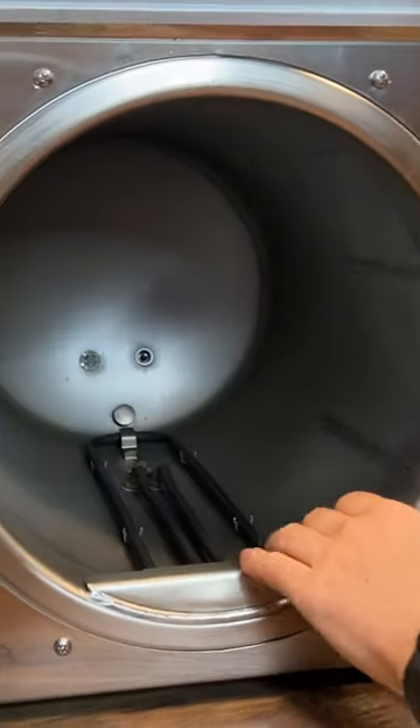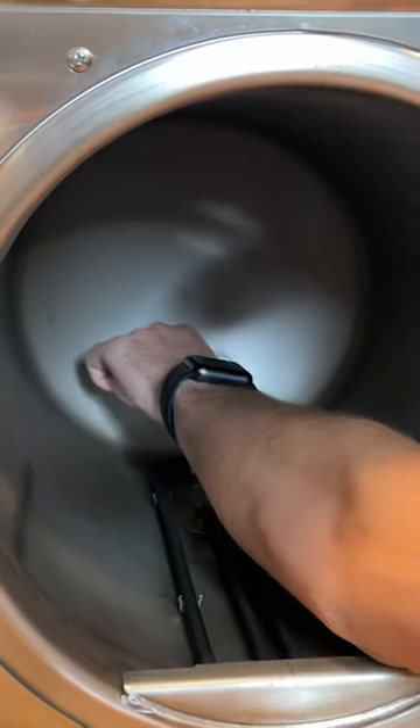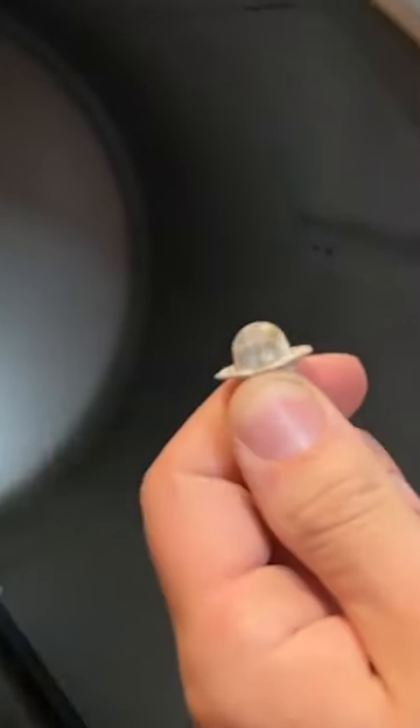Now, once you have your rack and your base plate out, you expose your chamber filters. You have one chamber filter in the bottom and one chamber filter up against the back wall. To remove those, you simply give them a little wiggle and they should pull right out.